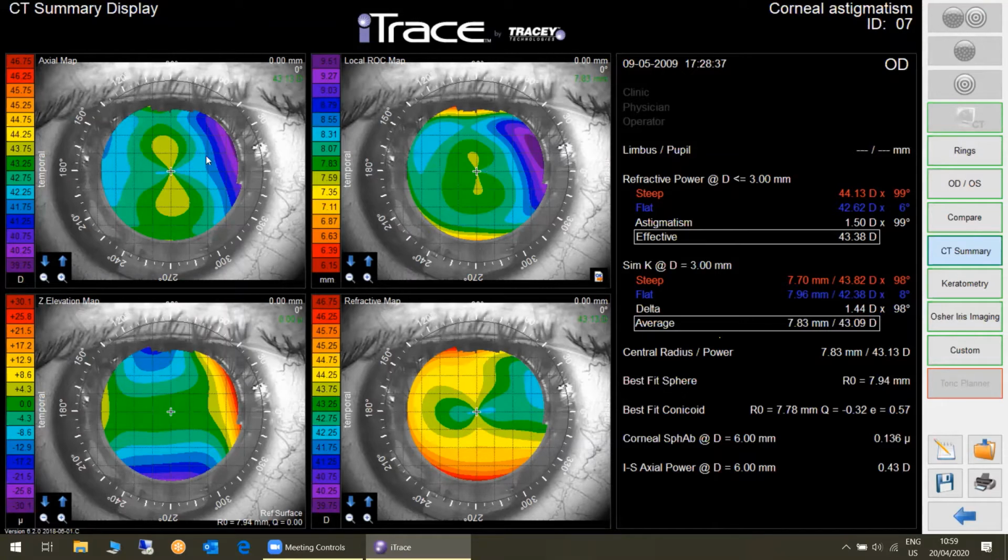And the third adjective that I use is symmetrical or asymmetrical. You see here, if this part is almost the same as this part, then we have a symmetrical bow tie. If one part is bigger, then we talk about an asymmetric bow tie. Why is this important? Because you can use a toric on asymmetric astigmatisms. You just have to be very careful for overcorrections.